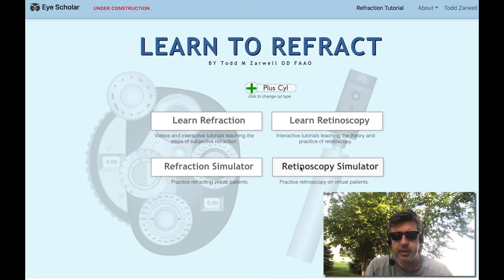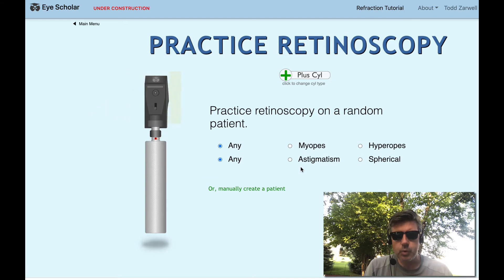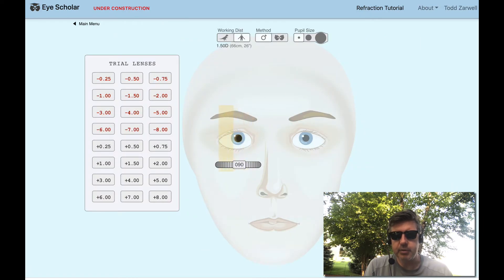Let's keep it in plus cylinder. Today, why don't we work with a random patient, but let's work with trial lenses instead of using the instrument.